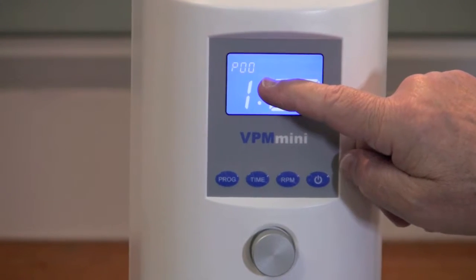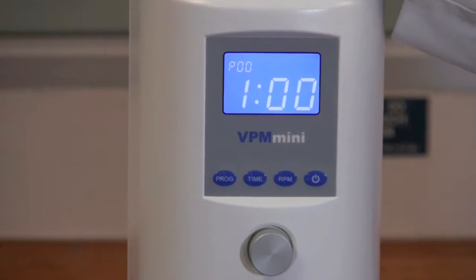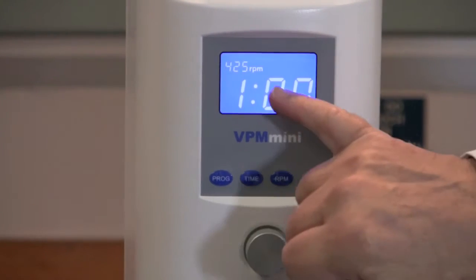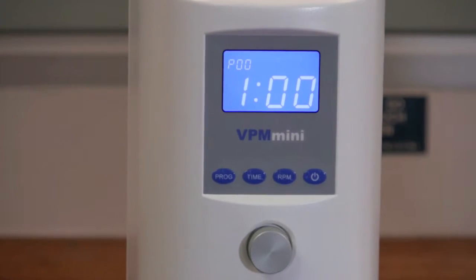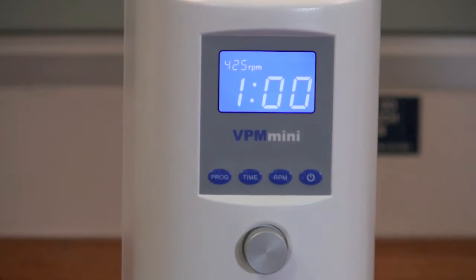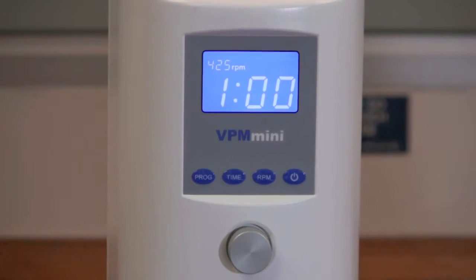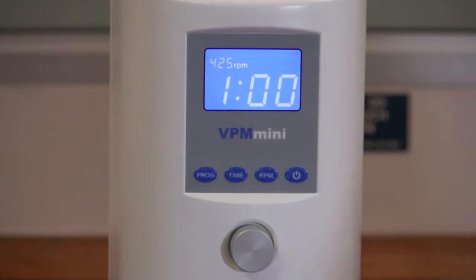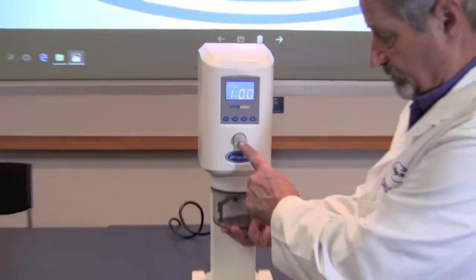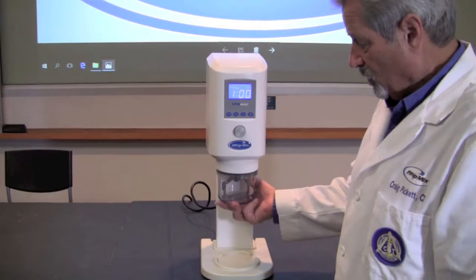Up here in the left-hand corner you're going to see something flashing. It's telling you first, where it says P00, that you're on program 00 and that the speed of the rotation of the paddles for this particular program is 425 RPM. It's also going to mix for one minute, which is shown on your screen. If we were to use that particular program we would place the bowl in place up in the throat and press the big silver button in the center to start the program.